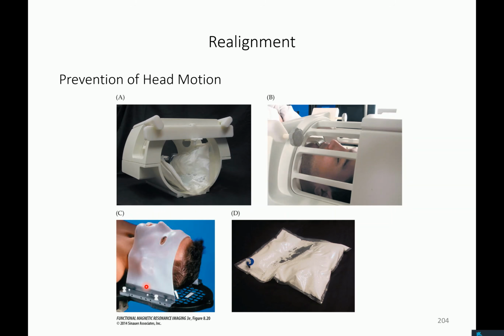So essentially you try to tell your participant that they shouldn't move. And he's even naked, as it looks, right? He doesn't seem to wear anything. That's completely weird. Anyway, that's the prevention of head motion. So that's the most important thing. Tell your participant to not move their head, and also try, if you're a participant yourself, not to move your head.